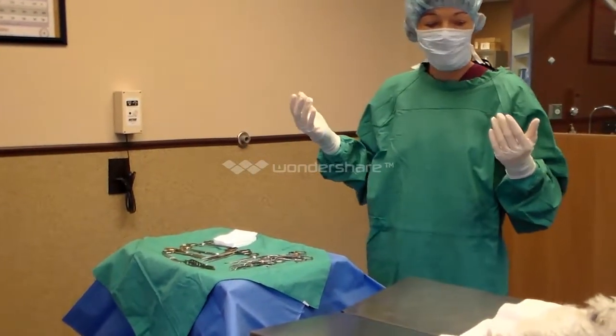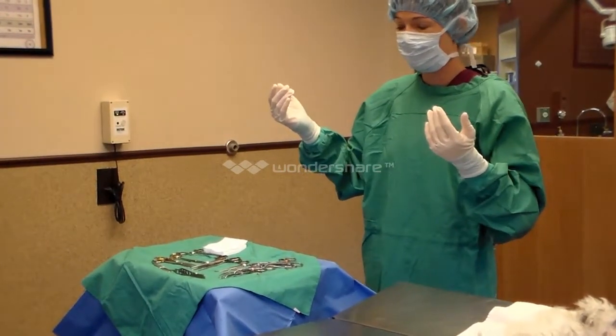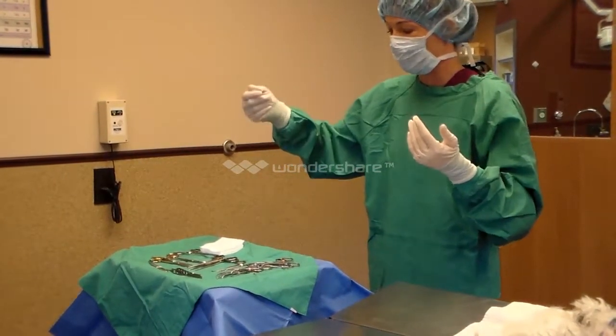We're ready to drape our patient. We're going to do a 4-towel drape.